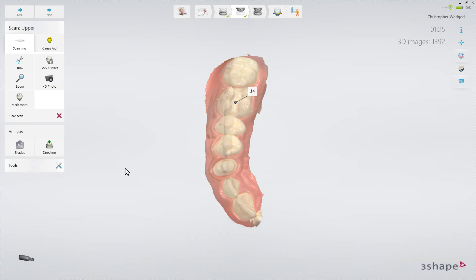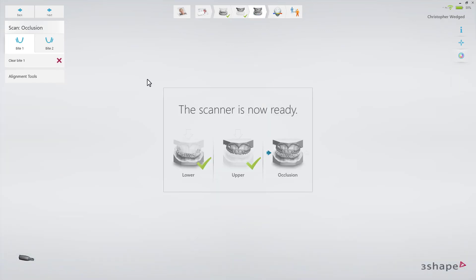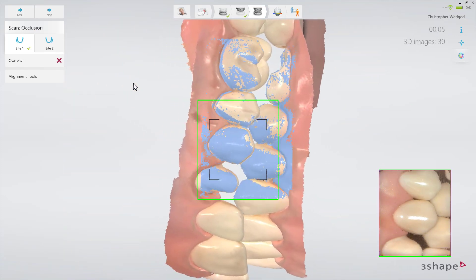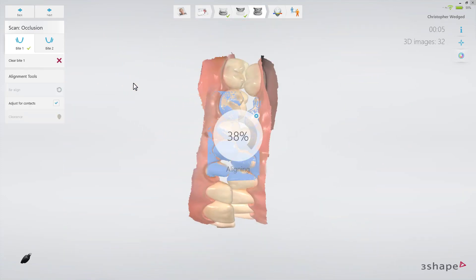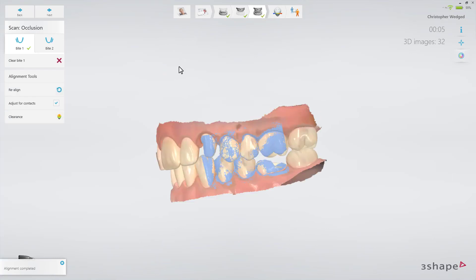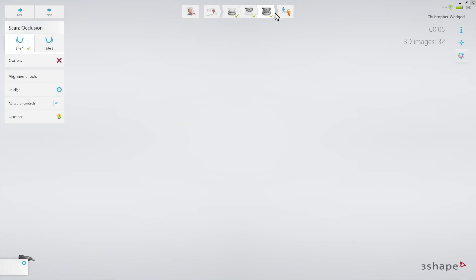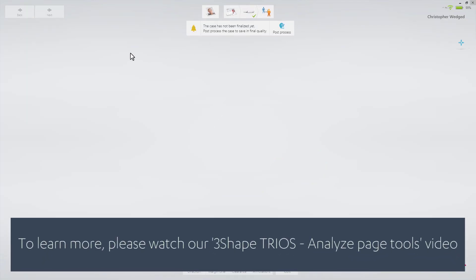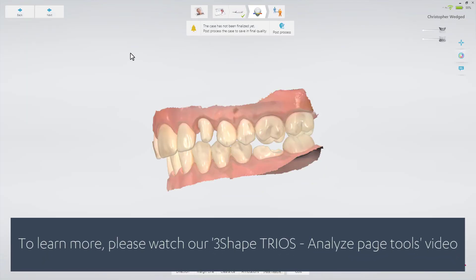Now move to the bite scan page. Proceed with scanning, following the official scan strategy. Go to the analyze page and confirm that there is enough space for the reconstruction between the upper and lower jaw, using the clearance tool.